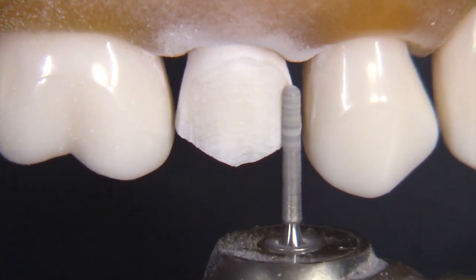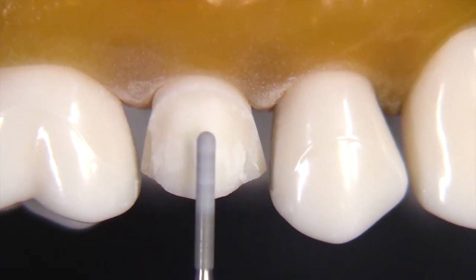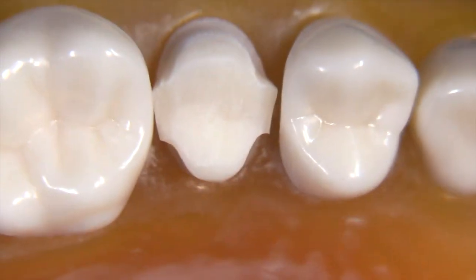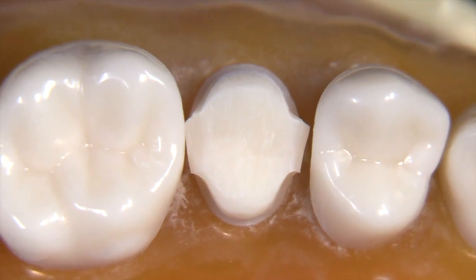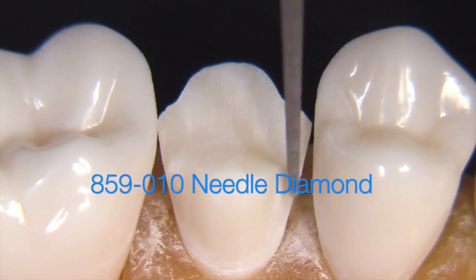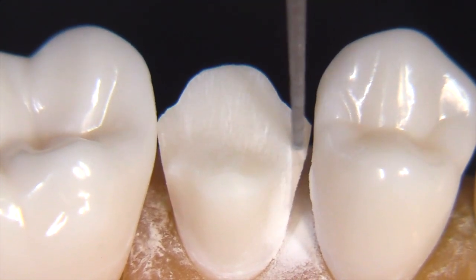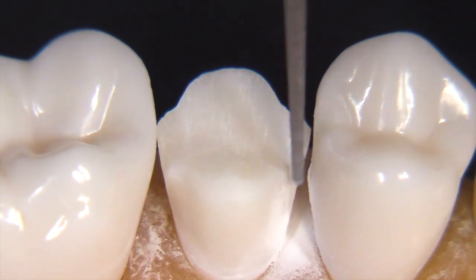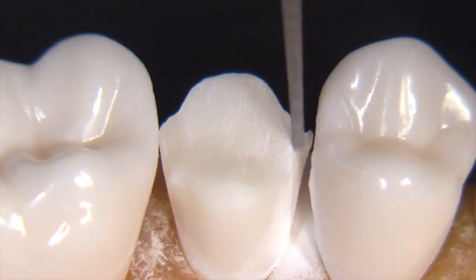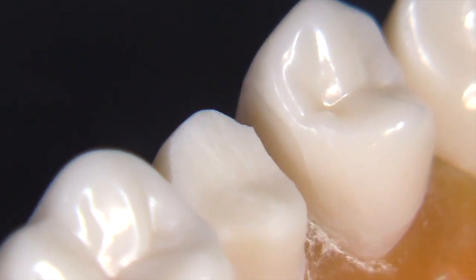For the interproximal slicing technique, we're going to pick up a skinnier burr — specifically a needle-shaped burr called an 859010. Watch the way I take the burr from the gingival aspect and slide it uphill. It's not just pushed through from the lingual or facial, but an angled approach — almost like the burr is going uphill or up some steps. Each time I go back, I get the burr a little bit further gingivally. This technique works really well for removing tooth structure without hitting the adjacent tooth — nothing there at all, no scratches.